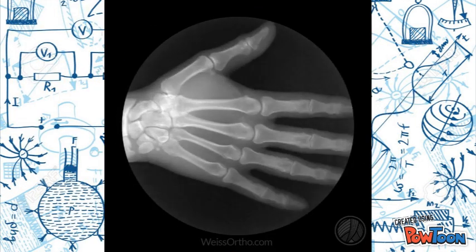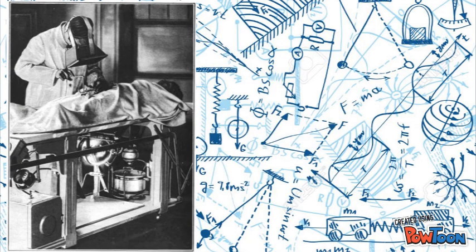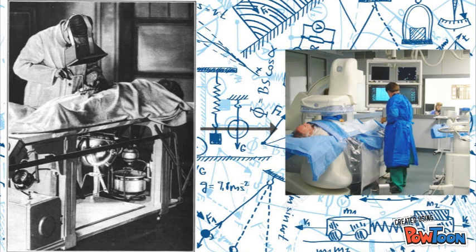Overall, fluoroscopy has helped millions of patients worldwide and has allowed doctors to easily examine the body. Even though fluoroscopy used to be incredibly dangerous for doctors due to inadequate radiation protection, recent technological advancements within the radiology community have helped improve safety standards around the globe.